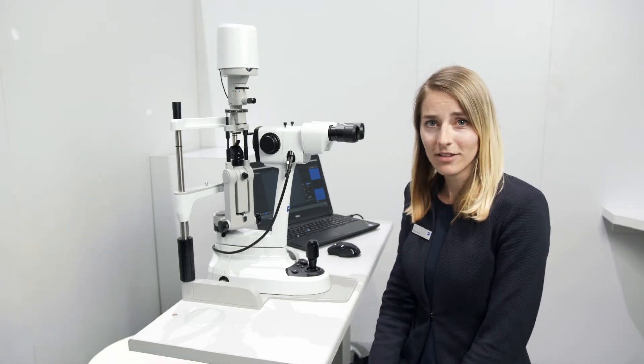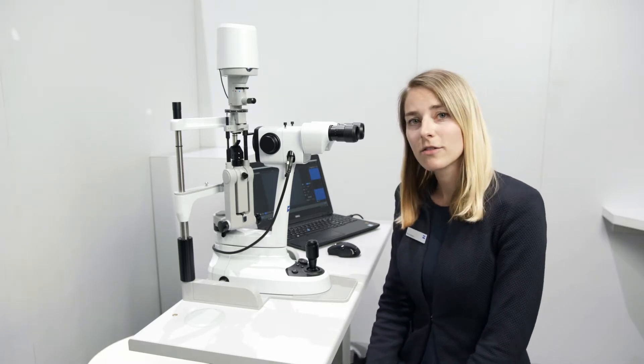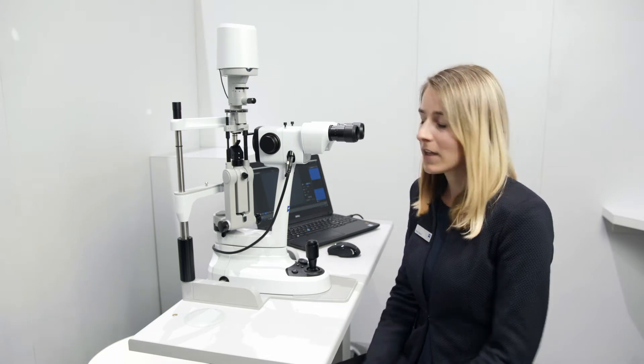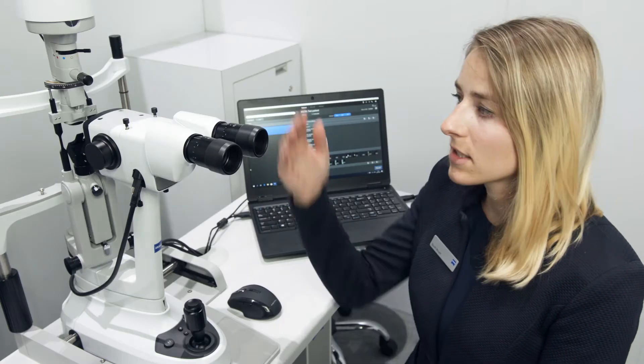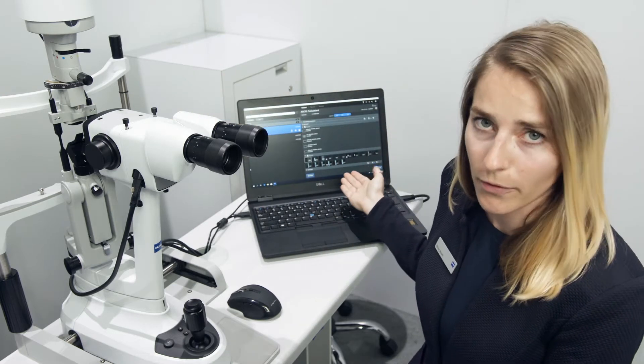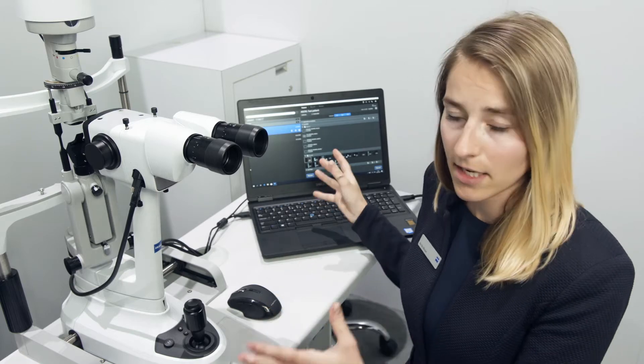Hi everyone, my name is Nicole. I'm product manager for Essential Line and today I have the pleasure to introduce you to our new premium slit lamp, the SL800. The SL-imaging solution consists of a camera and the SL-imaging software. We will present this in combination with the new slit lamp, the SL800.